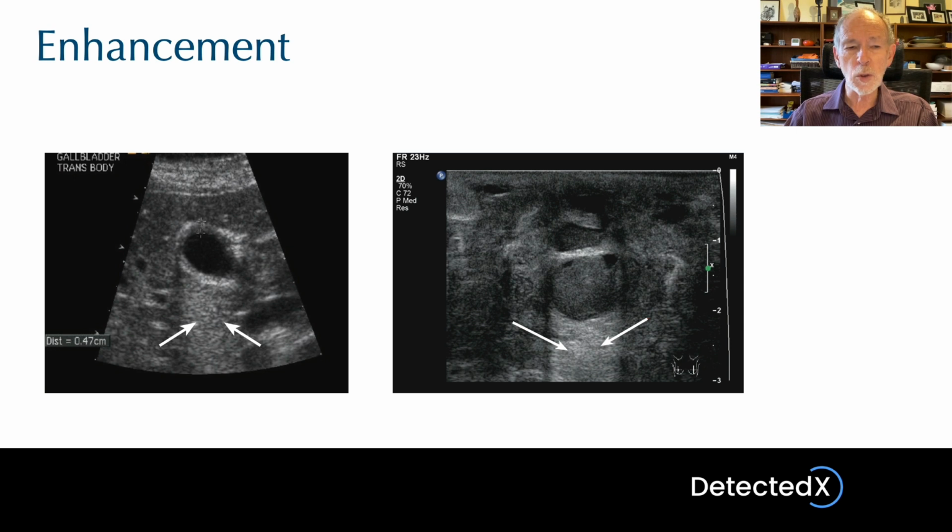Now, this is happening, of course, because when the ultrasound passes through the gallbladder, there's less attenuation than the machine is expecting, because the attenuation in liquids is low. And so the energy in the deeper tissues is stronger than the machine expects, therefore the echoes are displayed brighter than they should be. So enhancement is often useful in detecting the presence of fluids.